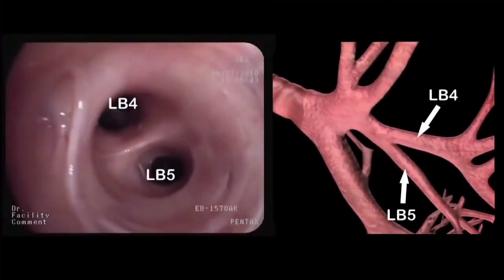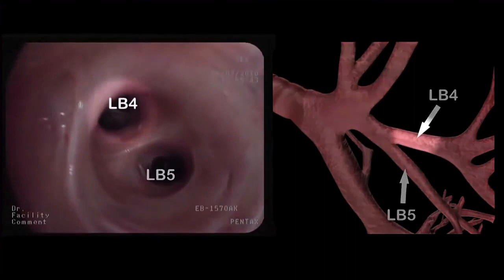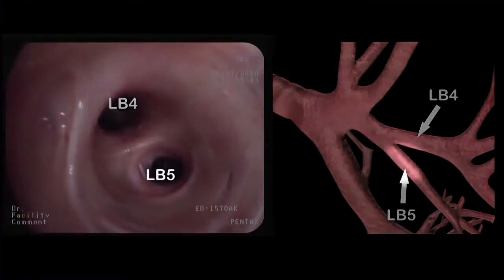The lingula bronchus divides into the superior segmental bronchus or LB4, and the inferior segmental bronchus or LB5.